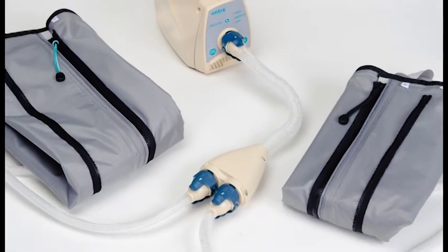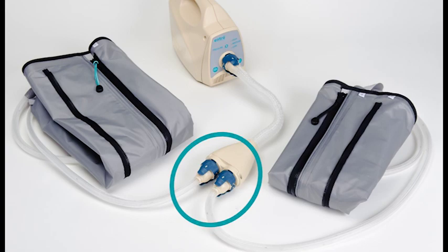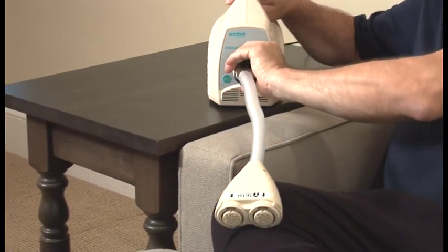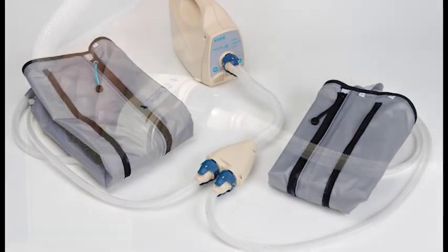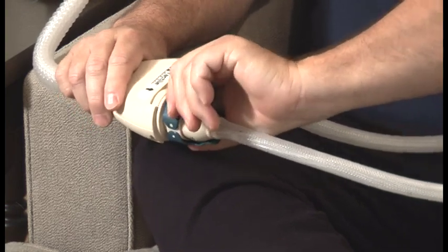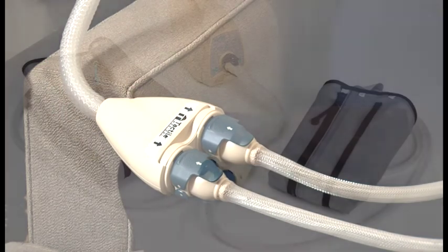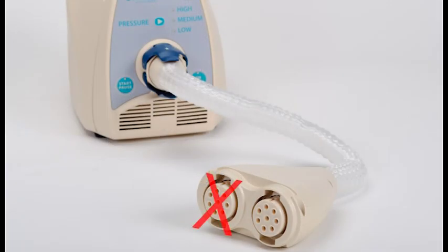If you are treating two extremities, known as bilateral therapy, you will have received a Y connector with your shipment. Attach the Y connector to the controller unit following the same process — you should hear the connector latch click twice if attached properly. Once successfully attached, connect each garment hose to the ports on the Y connector. If you are prescribed bilateral therapy but choose to complete therapy on only one limb, remove the Y connector and connect the hose directly to the controller. Do not leave a connector port open on the Y connector.